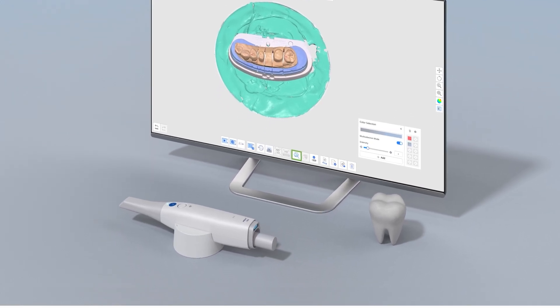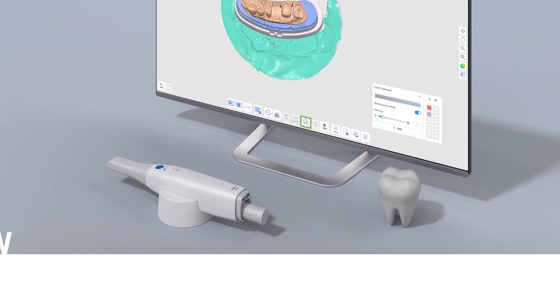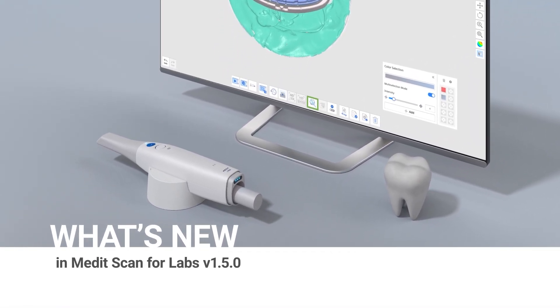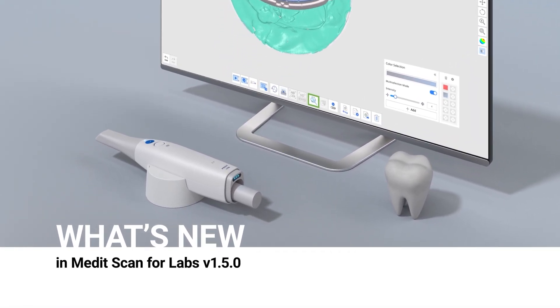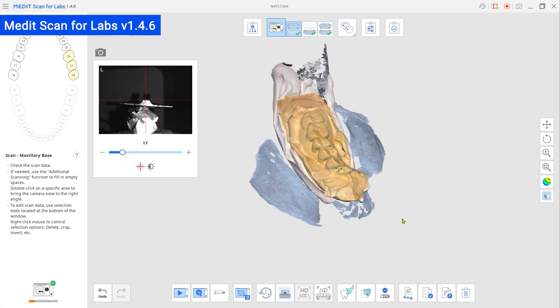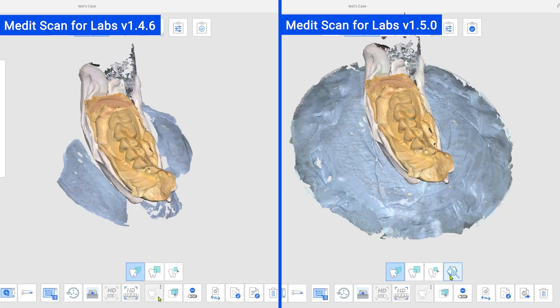We'd like to introduce the updated version of MeditScan for Labs. First, let's look at the newly added feature: the color selection.